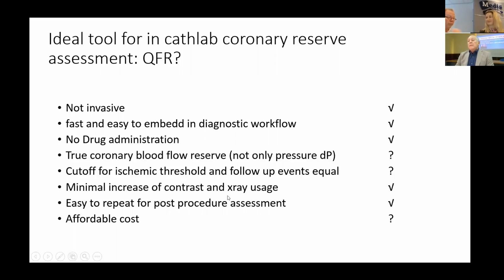Minimal increase of contrast and X-ray usage. Yes. Easy to repeat. Yes. Cost, okay, we don't know the Medis cost policy, but we hope that the cost will be much less than the actual guide wire and equipment. Thank you. Did I finish here?